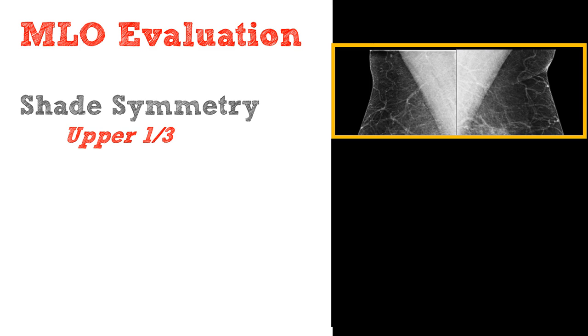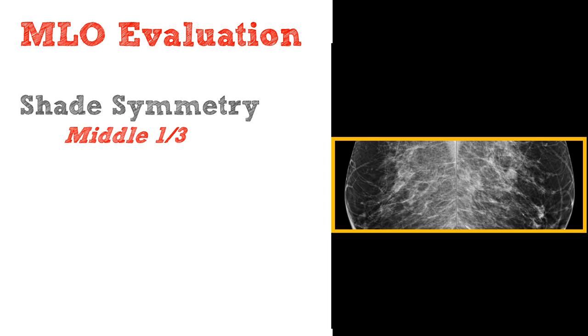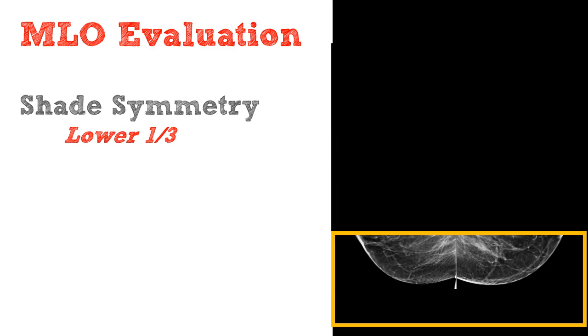From here, you're going to look closer at the MLO view. We're going to employ a technique called shade symmetry. We are going to look specifically only at 1/3 of the breast at a time. When you first do this, you may want to actually take a piece of paper and cover the rest of the breast. This will allow you to really focus in and compare side to side with the right and left breast. So we're going to start looking at the upper third, then moving to the middle third of the breast, and finally to the lower third of the breast.